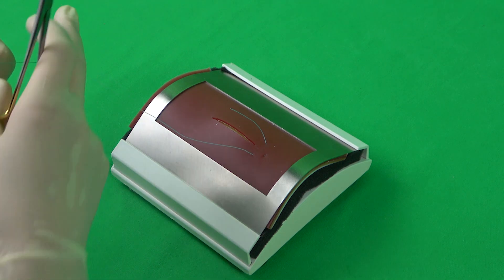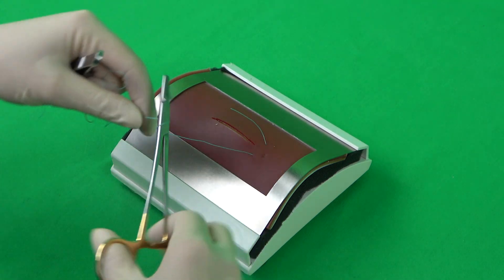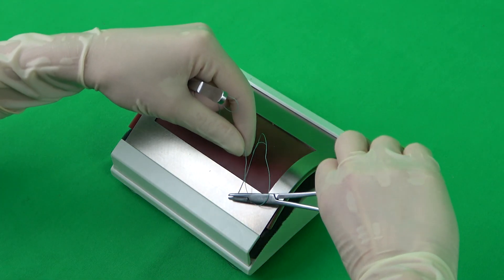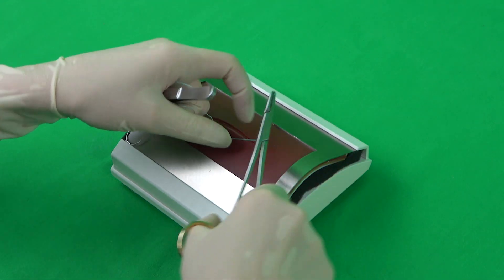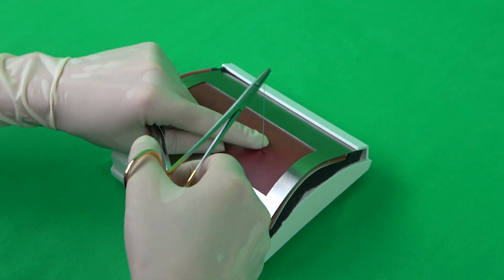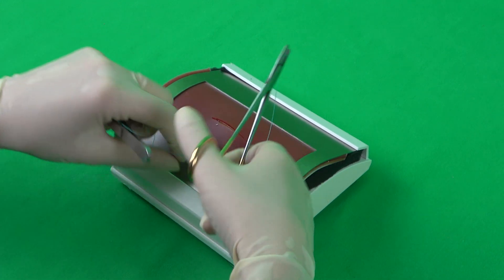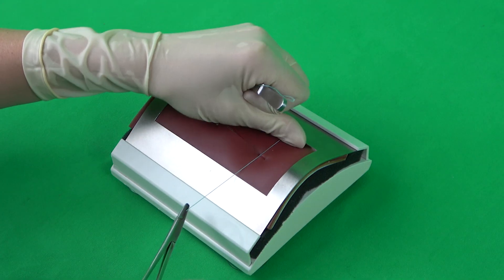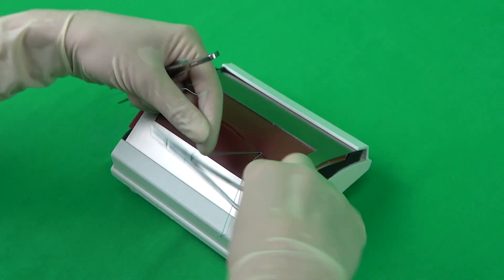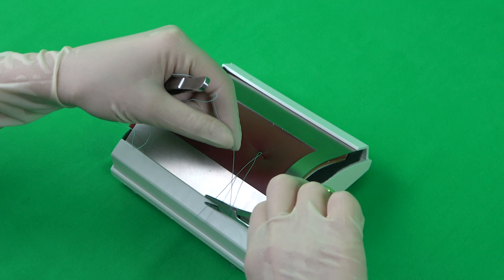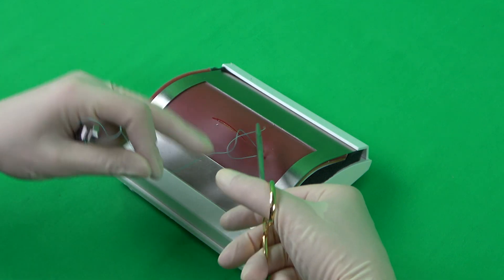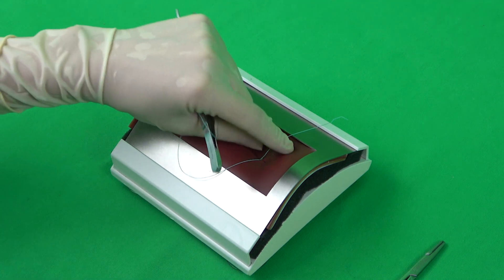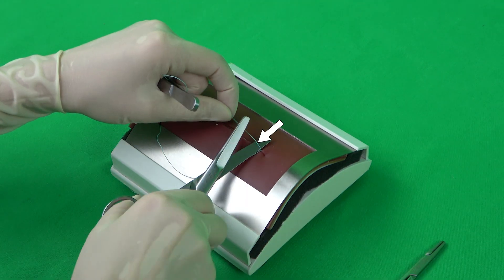The ends of the suture material can now be fixated with a surgical knot. It is also possible to utilize a slipknot for this, which is demonstrated in this video. Finally, the remaining thread can be shortened to one scissors blade's width.